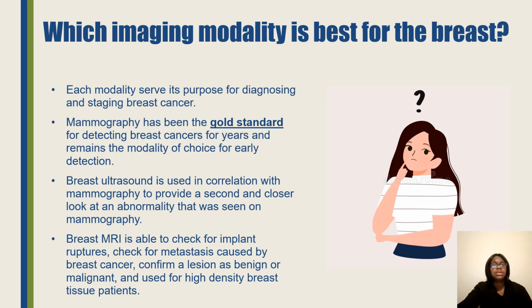And then also, this is just going to reiterate that mammography is the gold standard at detecting breast cancer, although we still use breast ultrasound and breast MRI for second looks, second checks to provide a closer look at some type of abnormality that was seen on mammography.